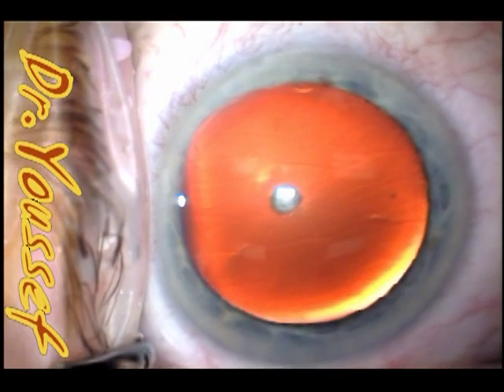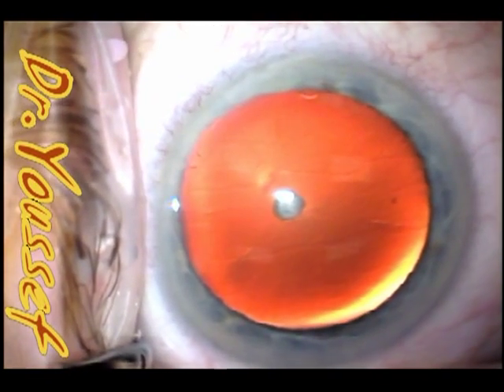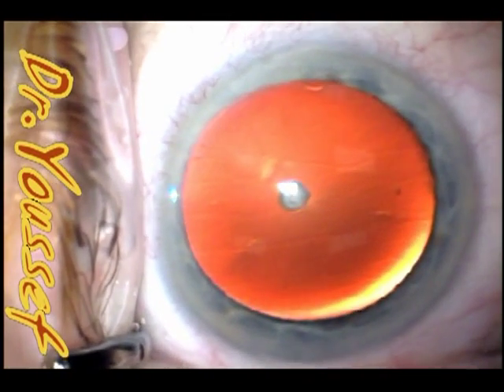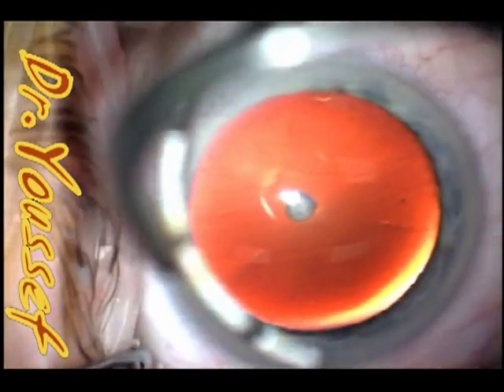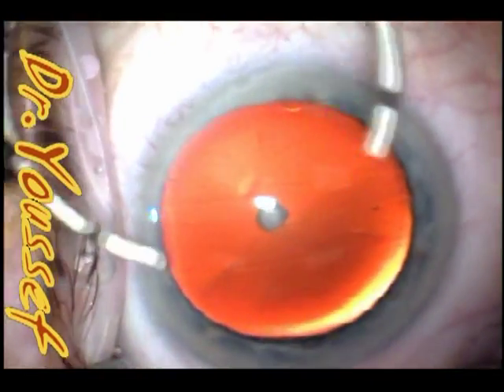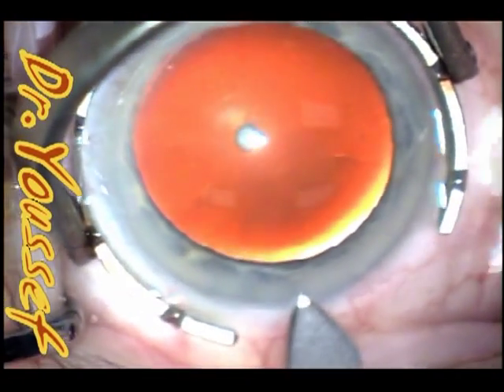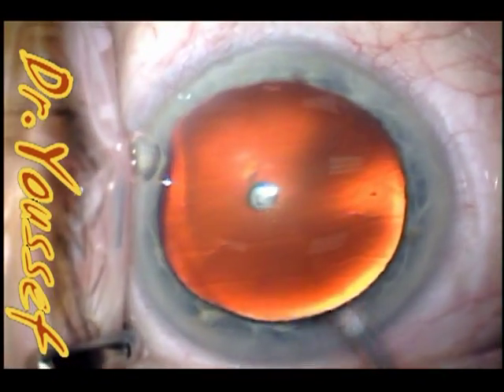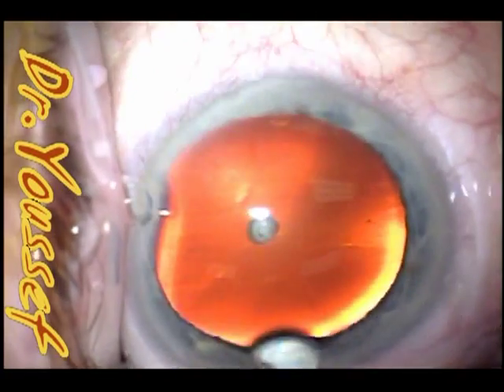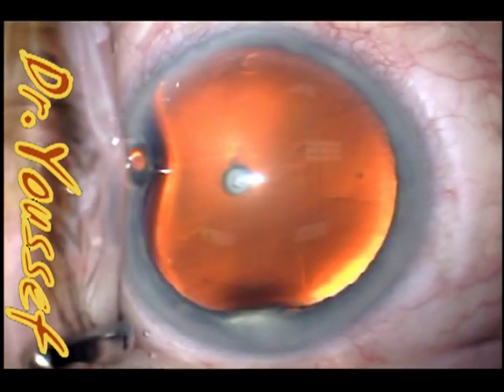This anterior pole cataract is stuck to the anterior capsule, and you find that it's coming off when we do the capsulorexis. It's not that difficult to remove, but you have to be cautious with it when you do the capsulorexis to be included in the flap that you create. When it's in the posterior capsule, there's a high chance of getting a posterior capsule tear when you remove it, because the capsule is actually included in the cataract.